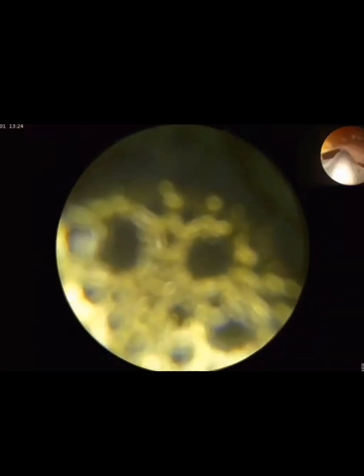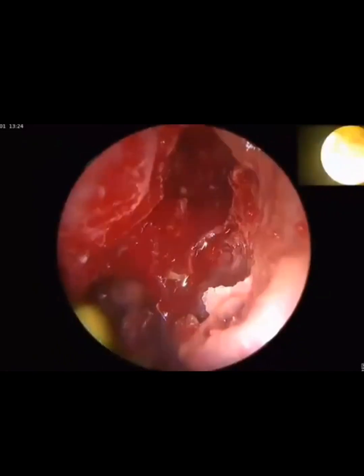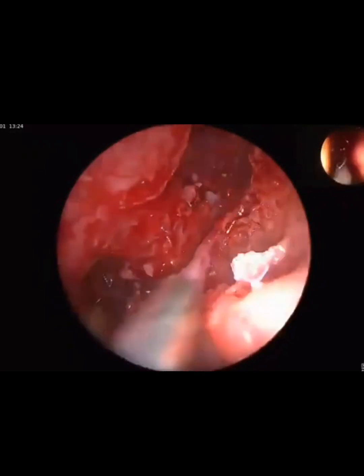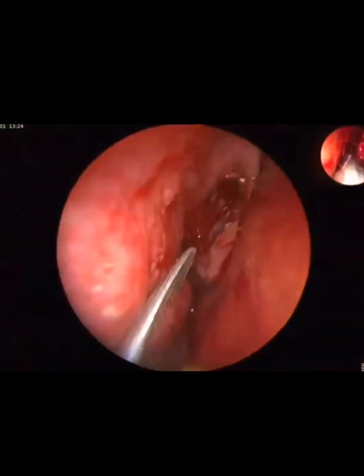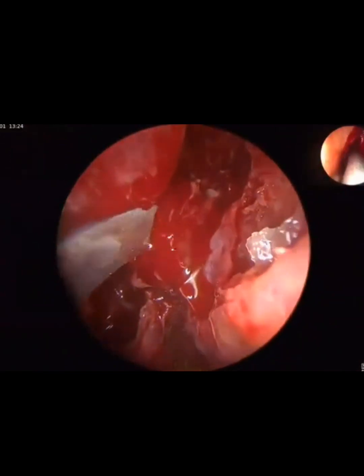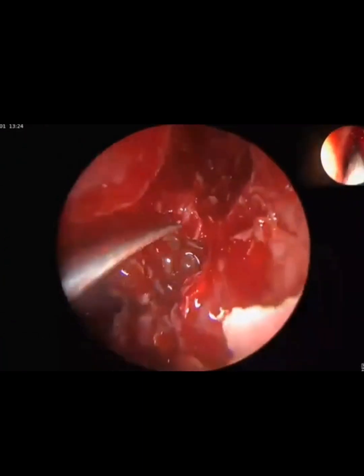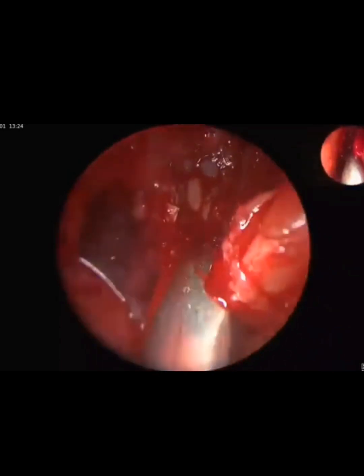Straight suction, straight suction. Please pass the periosteum. This is the bulla. So I am using a periosteum elevator to remove the major chunk of the bulla. Insert the periosteum parallel to the lamina, go behind and break it inferiorly. See, so we can remove the major chunk.